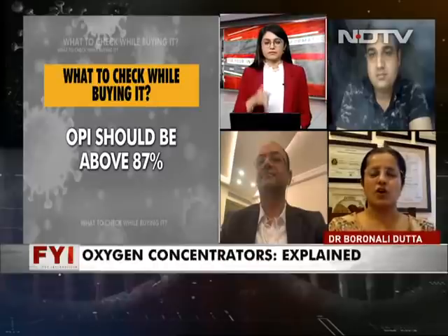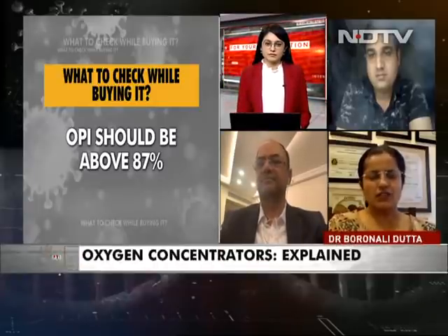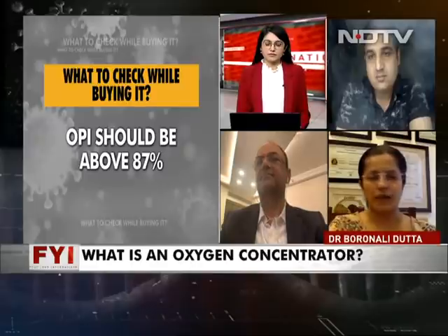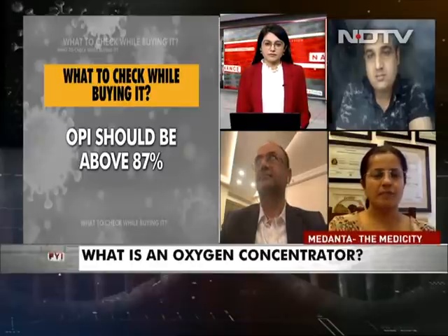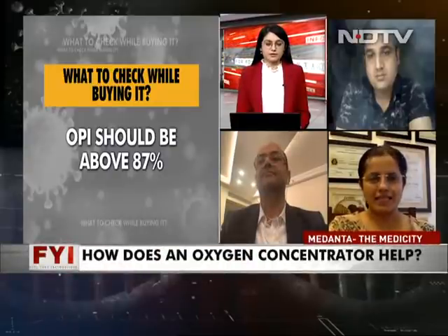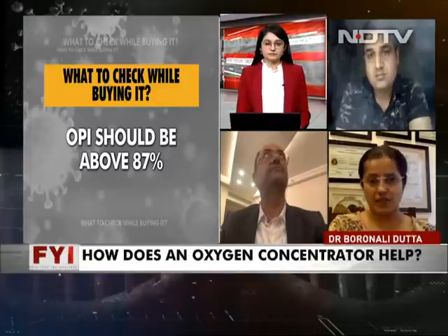You did point out that hospitalization should be considered, or at least consultation with doctors. Because of the dire shortage of hospital beds, I think the domiciliary oxygen concentrator is being used by everyone quite effectively. People have got a handle on it. But it is very important to be in touch with medical teams, with doctors, and understand the limitations as well.